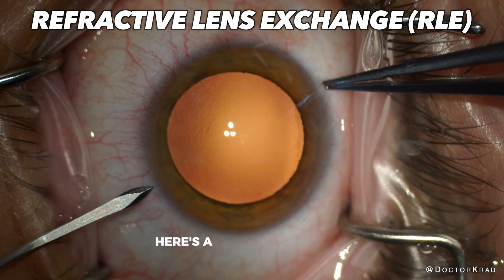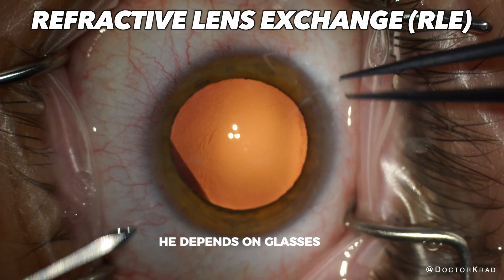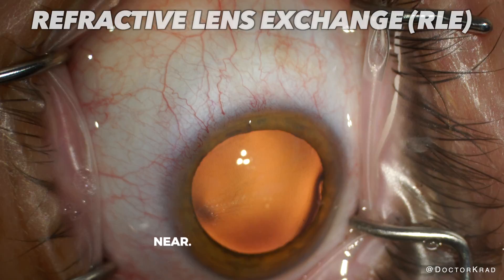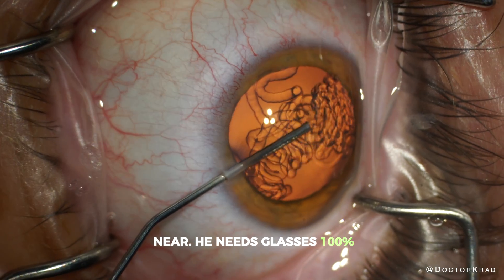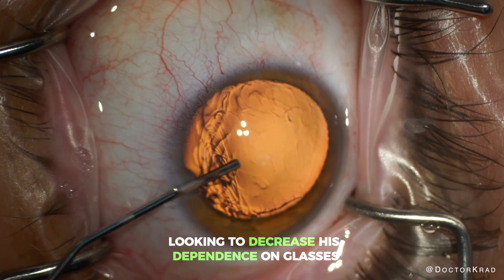Hi everyone. Here's a 50-year-old patient who is a high hyperope. He depends on glasses for everything — for far, intermediate, and near. He needs glasses 100% of the time. He came in looking to decrease his dependence on glasses.